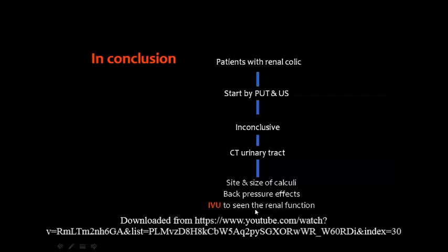By this technique, you can detect the site of the calculus and its size as well, and you can assess if it is associated with back pressure effect or not. Then if you would like to know something about the renal function and you have to inject the contrast material, then use intravenous urography as a complementary test.